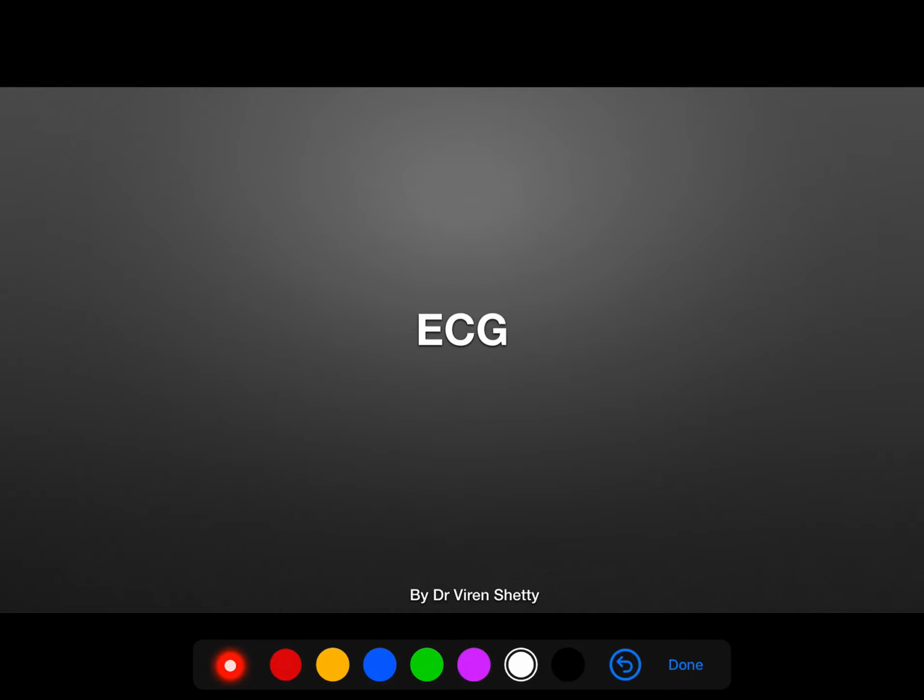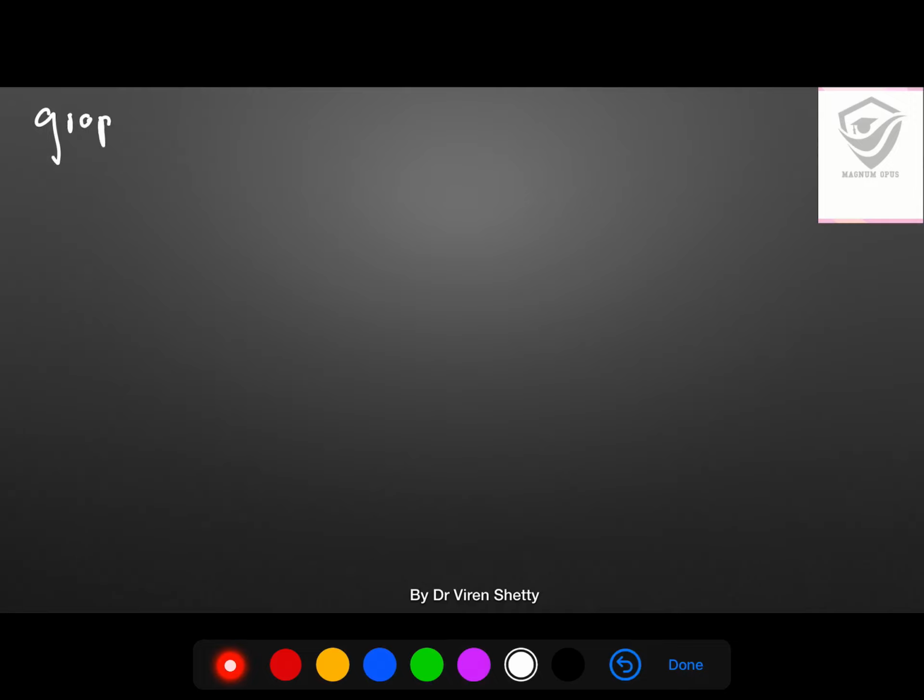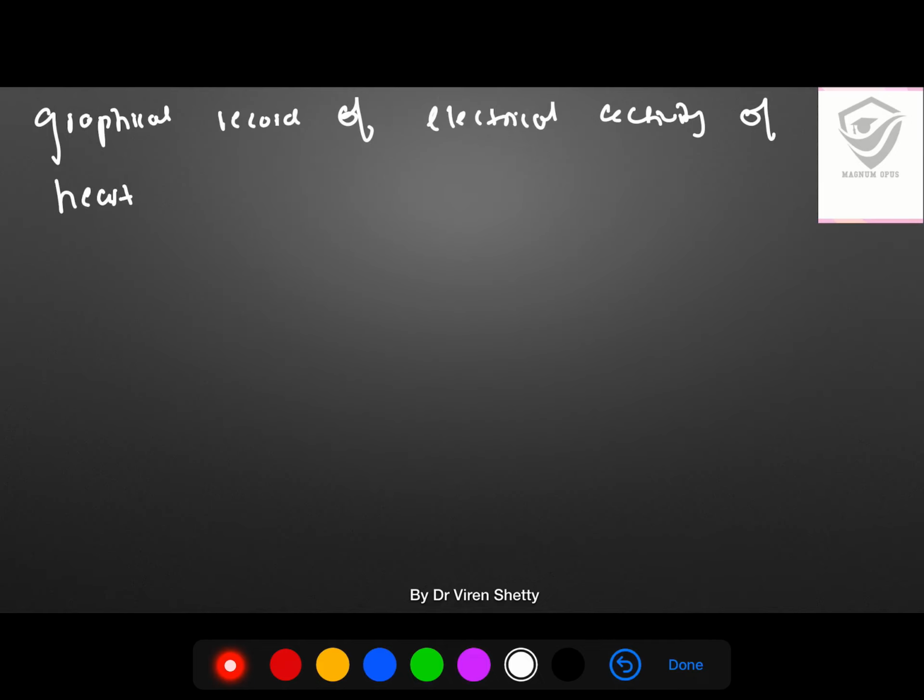This lecture will study regarding ECG. ECG, also remember, is known as EKG. So what is ECG? It is a graphical record of the electrical activity of heart, which is recorded from your body.